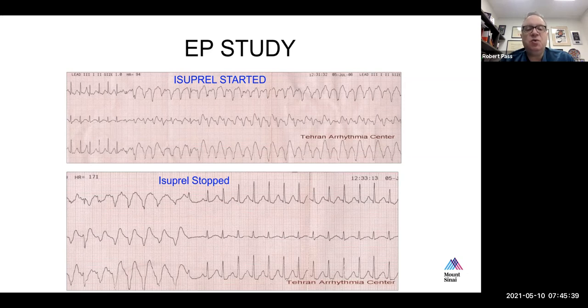And that's in fact one of the reasons why people worry about defibrillators in those patients. If you are in this arrhythmia but are not unconscious, at least for a short period of time, and you get shocked, you're going to be in a lot of pain, and it could actually cause a VT storm because you'll get upset about getting shocked. So a lot of experts feel that ICDs are inappropriate for patients with CPVT because they might trigger a storm of ventricular tachycardia. Most do not believe that. What you would hope is that you would program it in a manner that the patient would have fallen unconscious by the time they were shocked. But you always have to be careful about this.